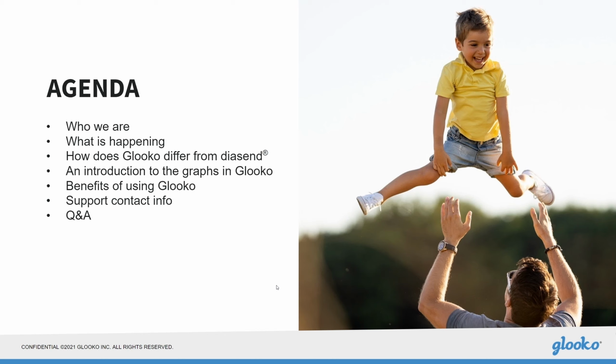And we're also going to be looking at Glooko in greater detail, both how it differs from Diasend, as well as some of the graphs and charts within the platform, and some of the benefits that it is going to provide to both clinics and patients. We're also going to touch on the support that is available for clinics as they make this upgrade. So we are going to have people supporting you every step of the way. There's going to be plenty of resources to assist you. And finally, as I said, we're going to round out with a Q&A where we'll address any questions that you've inputted throughout the duration of this webinar.